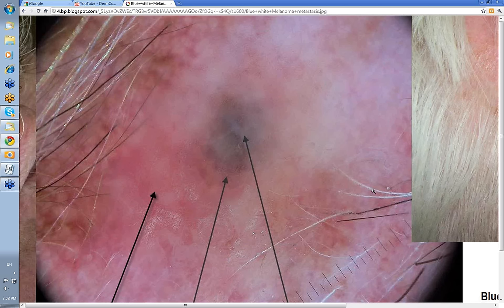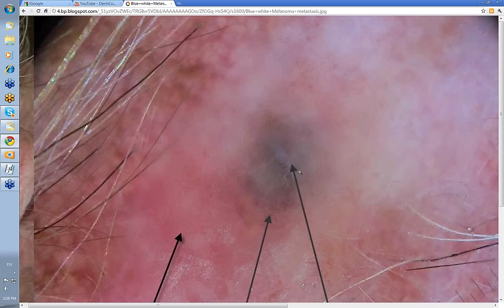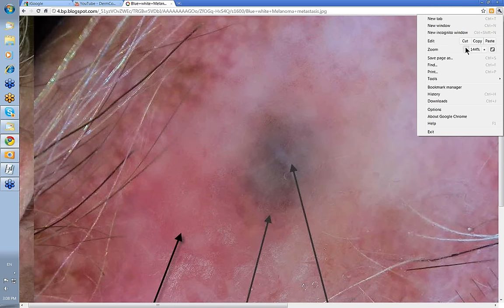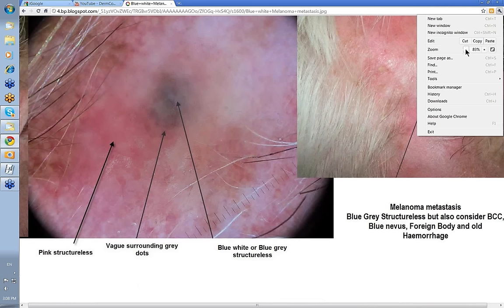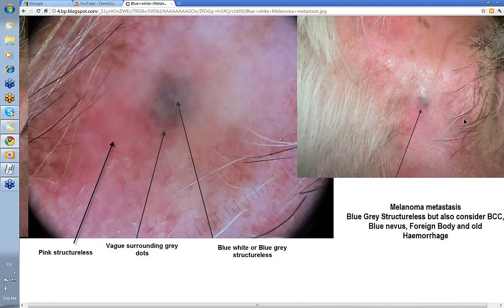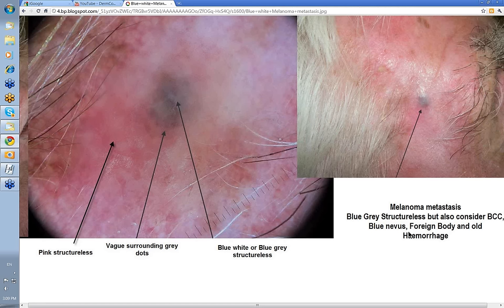This is a gentleman's temple — here's the clinical lesion near the eyebrow and scalp margin. You have this blue color with a bit of pink below it. When you look at it with the dermatoscope, you've got blue-white or blue-gray Structureless. With blue-gray Structureless, you've got to consider a melanoma metastasis, but also consider a primary melanoma, a BCC, a blue nevus. Remember foreign bodies and old hemorrhage — they can still give a picture like this. If you look carefully, there are some little gray dots there as well, and this pink Structureless area next to it.